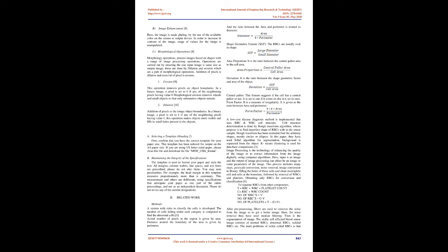The steps involved in detection are image acquisition, image segmentation, detection of abnormal RBC, and detecting the type of abnormal RBC. 6. In the analysis of medical images, techniques of digital image processing are important, which includes image enhancement, image filtering, segmentation, image masking, edge detection, etc. Contrast stretching, unsharp masking, edge detection, etc. are a part of image enhancement.